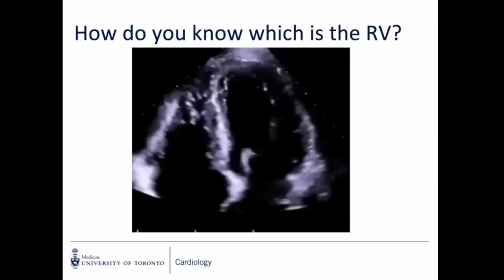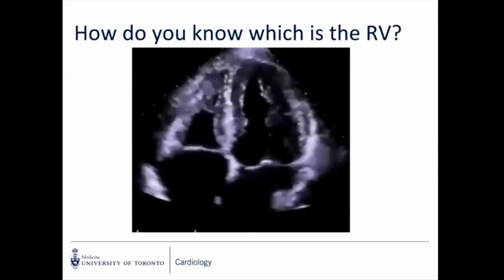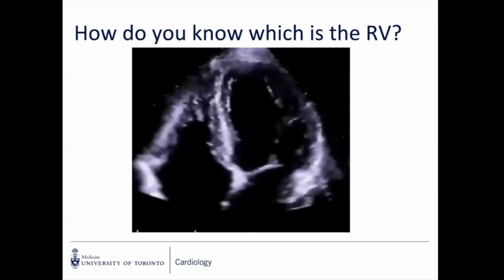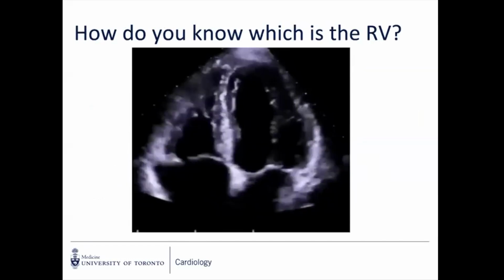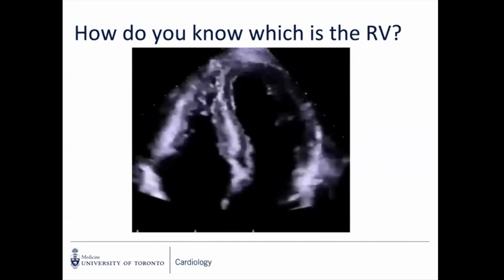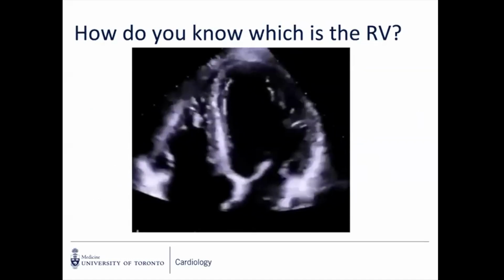It's just a quick question. Yazid asked me this a couple of weeks ago, and I didn't have a good answer for it. What's the difference between the LV and the RV, and how do you distinguish between the two? I don't want to spend too much time on this, so just general thoughts.